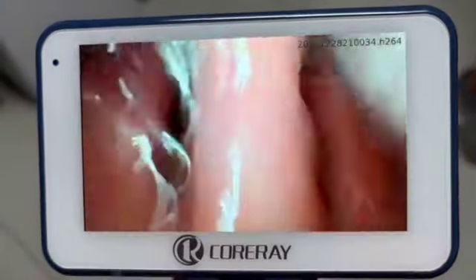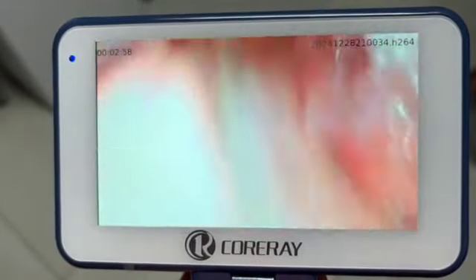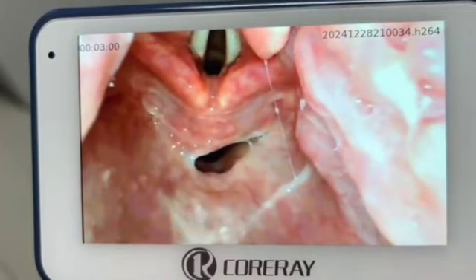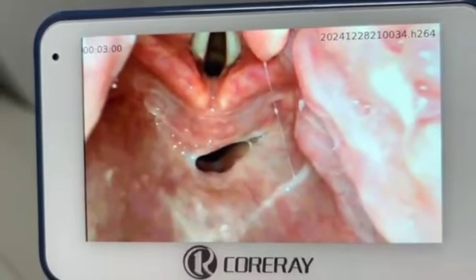Managed to get the blade into the right spots in the airway. You can see it just stick, used as a Miller blade, scooping that epiglottis up. This is the second massive learning point, and you can see almost immediately I realized that the angle is not going to be right.